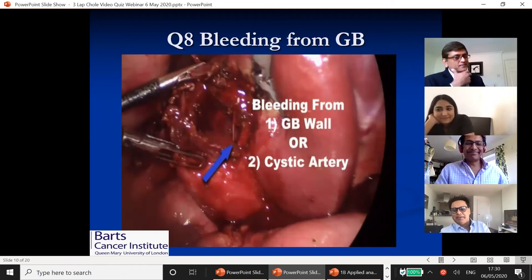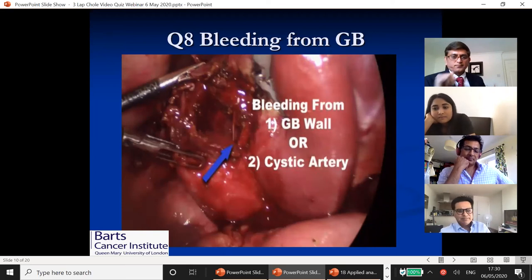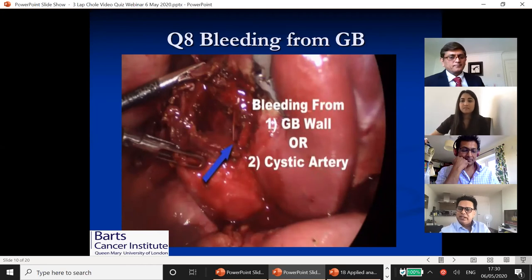Here, you're going to have to probably think about suturing, I guess, at some stage, and have the skills required for that, as it's hosing out from the bottom end, because this is difficult. It's hosing, it's difficult, you put pressure on. You find the isolated point. Are you dealing with a major vessel injury, or is it cystic artery? Can you safely diathermy? Huge questions here.